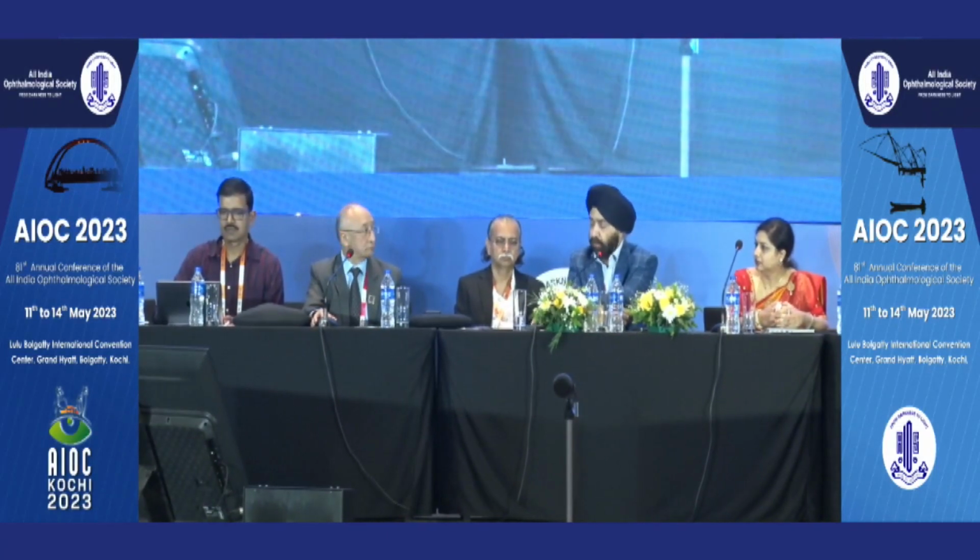And I think somebody will be talking about two different types of lenses that they are getting, which is the geometric, where you can have different light distribution between intermediate and near. I think Anurag did cover all the aspects, right from the ocular surface to specular microscopy, then looking for the aberrative profile of the internal aberration versus corneal aberrations.